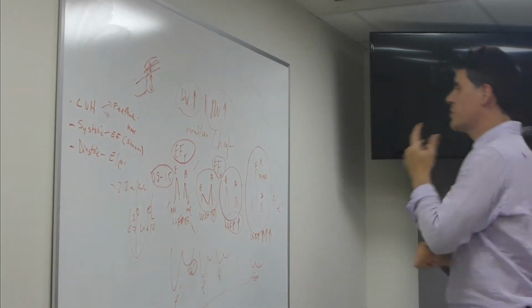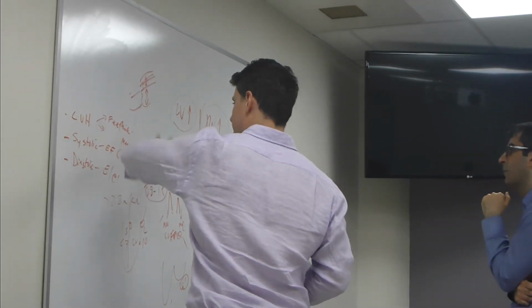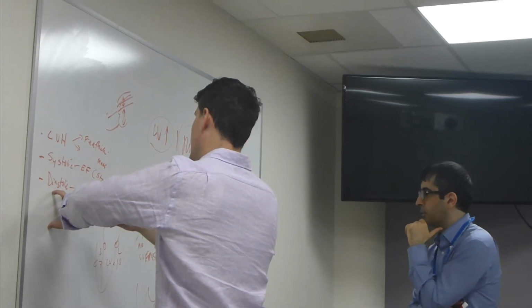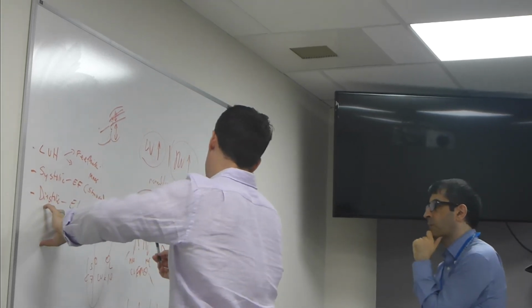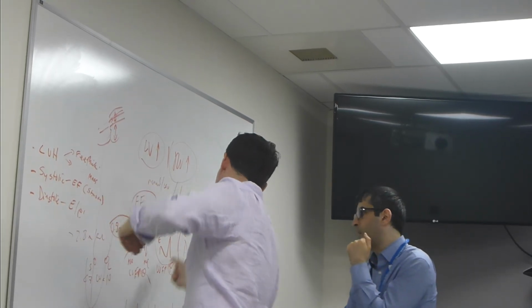So in terms of screening, LVH we measure, systolic function we measure, and then diastolic function. If they have preserved ejection fraction, you really need to look at this carefully. Absolutely. If they have a reduced ejection fraction, first of all, they've already screened in, so it kind of doesn't matter anymore. But we can more confidently tell the difference then because they're out of this category. If they have a lower ejection fraction, they're already over here.